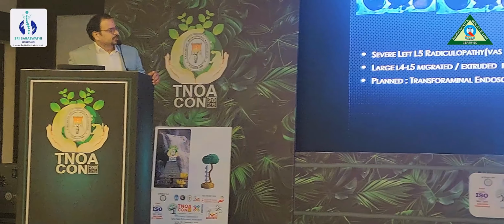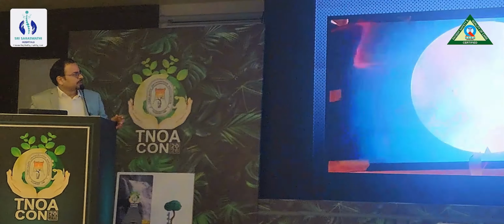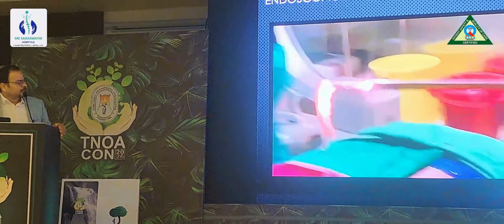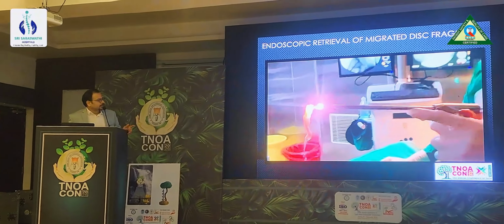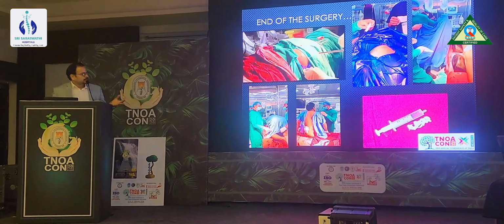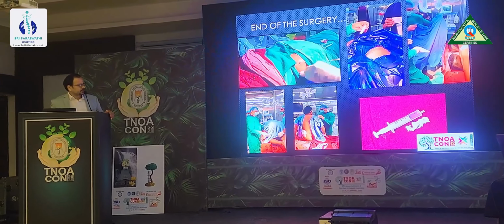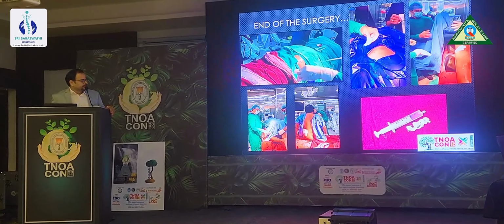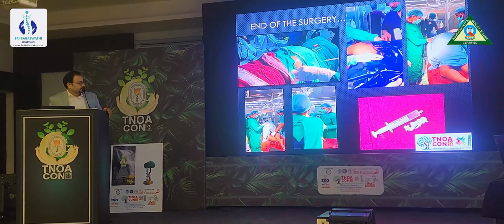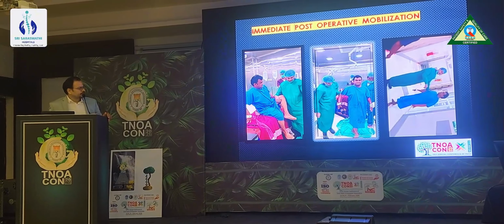We have planned for transforaminal endoscopic surgery. After initial preparation, we retrieved a huge fragment of disc which was compressing the nerve root, and after removing the disc fragment, a single suture was applied. The patient was mobilized from the table itself. He got significant relief.